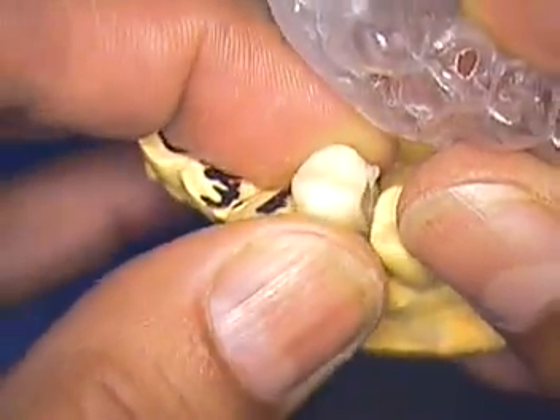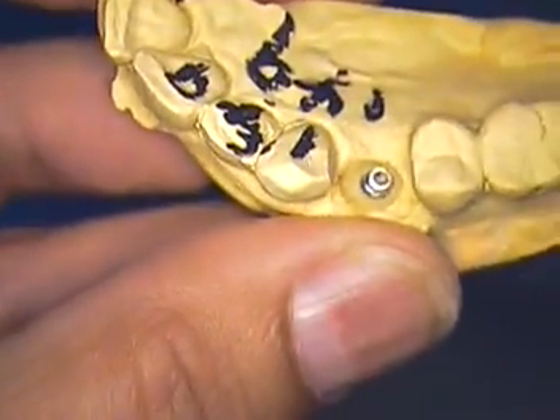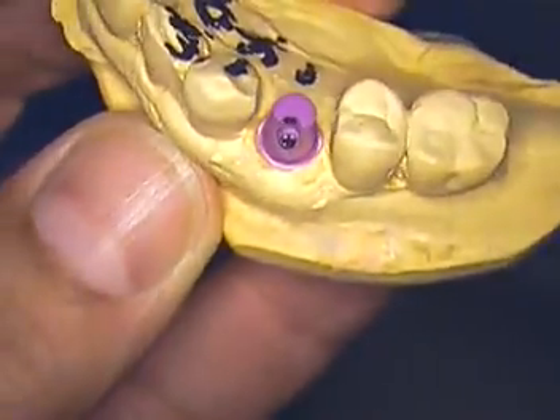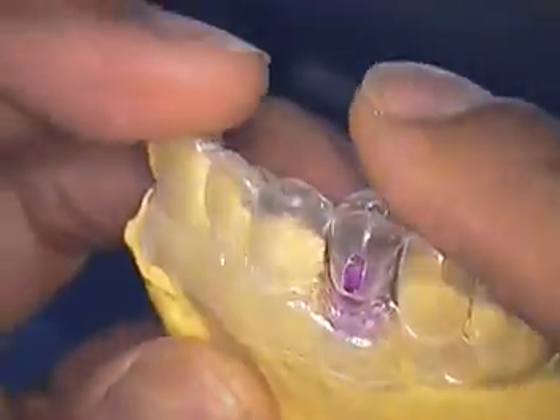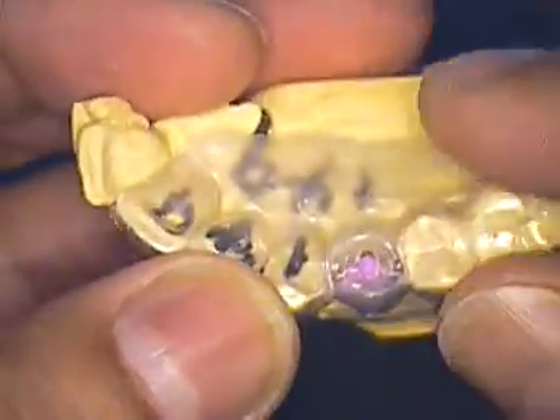Notice on the OmniVac we have three windows cut out, because I want to be able to take a periodontal probe and measure the actual distance between the outside and the inside — so I know how much thickness. Take away the wax guide, place our angled abutment, and put that in place. Then we put the OmniVac in place, take your periodontal probe, and come from each side to get an idea of how we're going to handle this case.